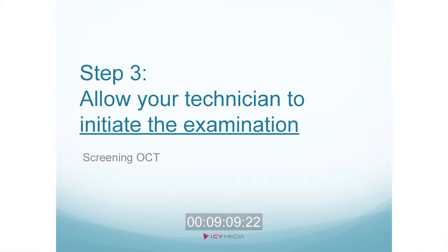Once we've obtained all of our history, it's time to start getting all of the screening information. So the screening OCT is the first step that we have our technician help us with as far as testing goes. And I emphasized in the previous webinars that you can use any type of instrument that you want. It could be an OptiView, it could be a Cirrus, it could be a Heidelberg Spectralis. But the most important part is that we want to make sure that the OCT has all the information on it that we want. We want to have some type of assessment of the retina, the retinal thickness, the ganglion cell complex.